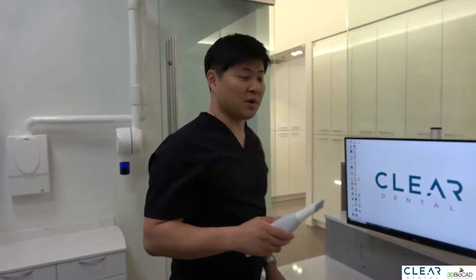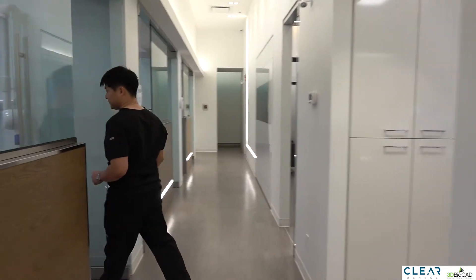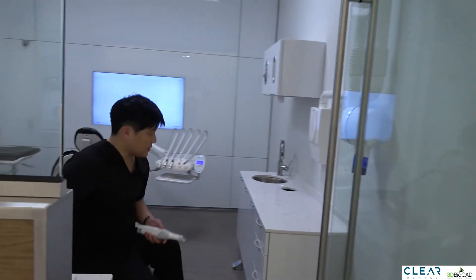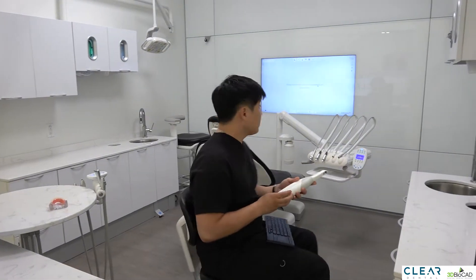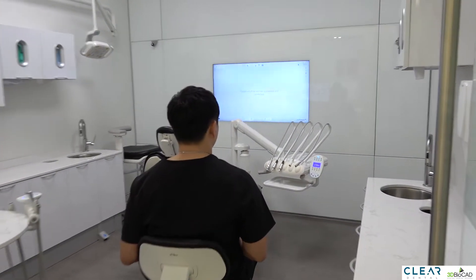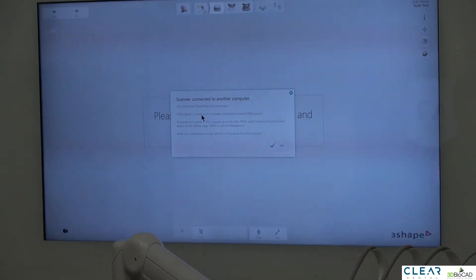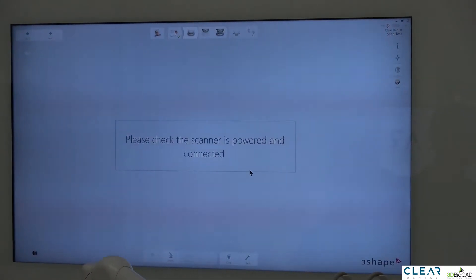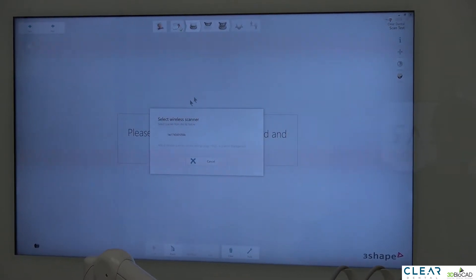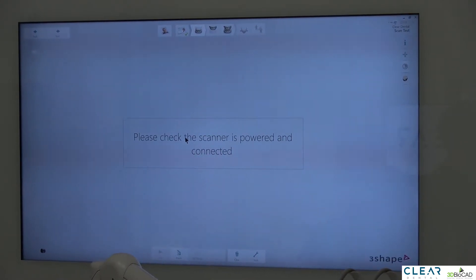Now I'm going to show you how to connect to another computer. As you can see, all you need to do is bring the TRIOS with you. Go to the upper right corner, click on the TRIOS icon, and then click on the scanner. Sometimes it says the scanner is connected to a different computer — if that shows up, just click OK, click the icon again, click on your TRIOS scanner, and then it'll connect.